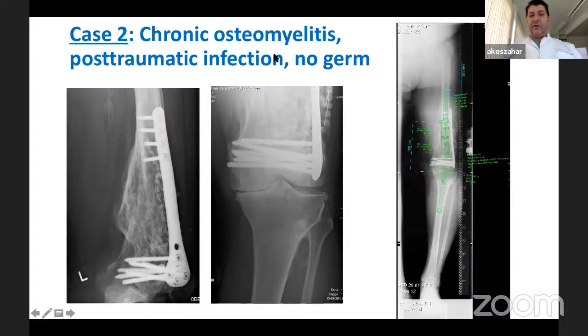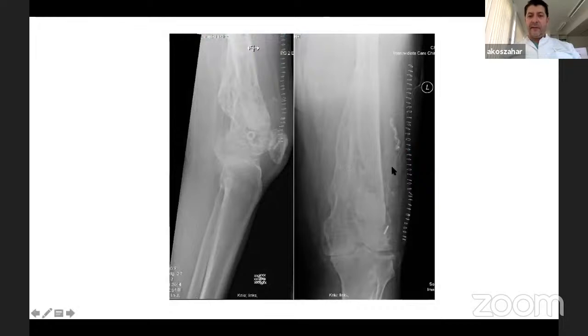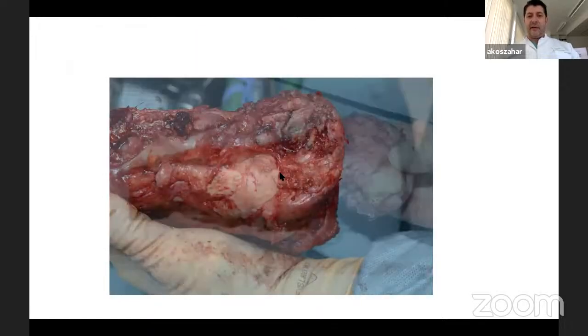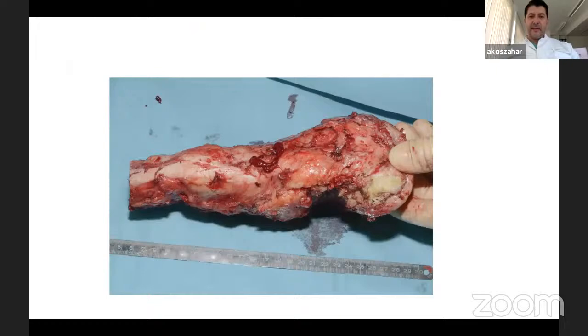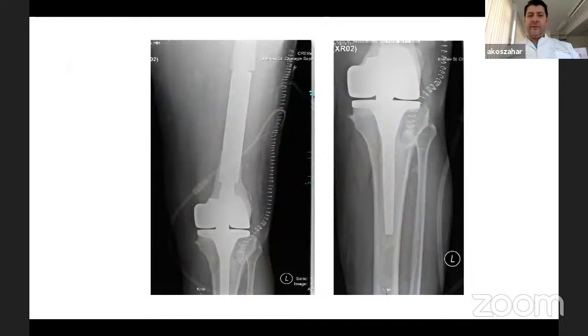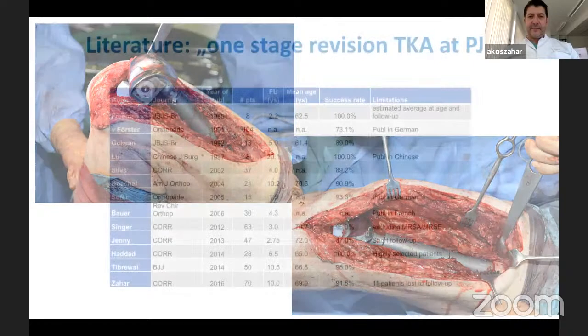Also, in this case, you have a chronic osteomyelitis, post-traumatic infection. We have no bugs in this case. You can see the old antibiotic beads. And of course, in this case, you have to go for open biopsy, remove the hardware, go for diagnostics, resect the bone, which is chronically inflamed and there's osteomyelitis. And then you go for the implantation with an antibiotic loaded bone cement and megaprosthesis.